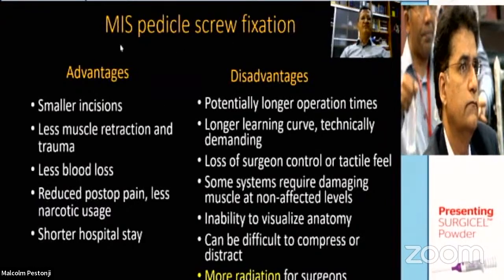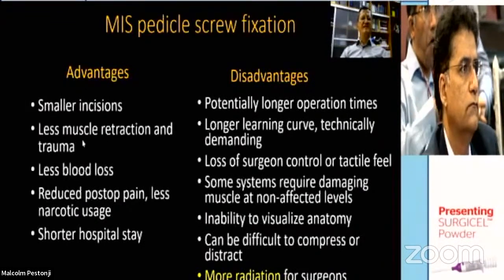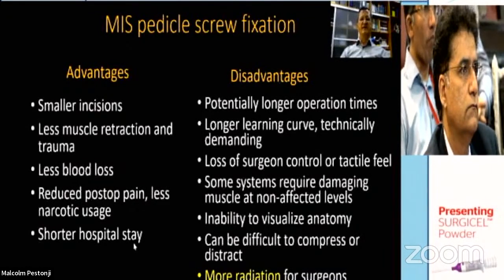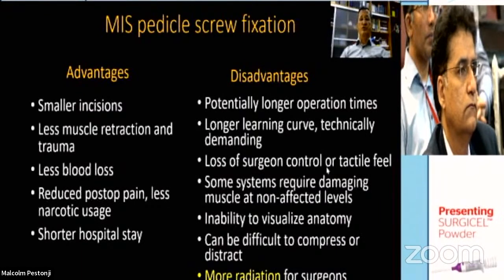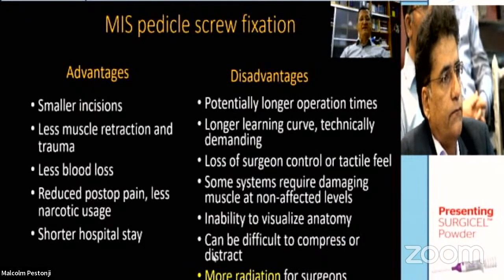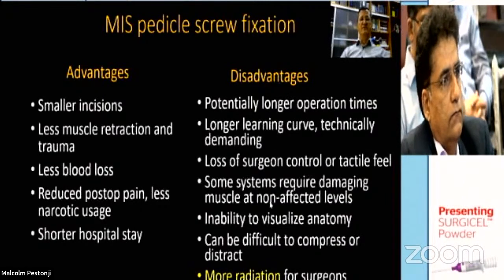MIS pedicle screw fixation has advantages: smaller incisions, less muscle retraction and trauma, less blood loss, reduced post-op pain, and shorter hospital stays. However, the main disadvantages are potentially longer operation times, a longer learning curve, being technically demanding, loss of surgeon control and tactile feeling, especially placing the rods may be quite difficult, and more radiation for surgeons.